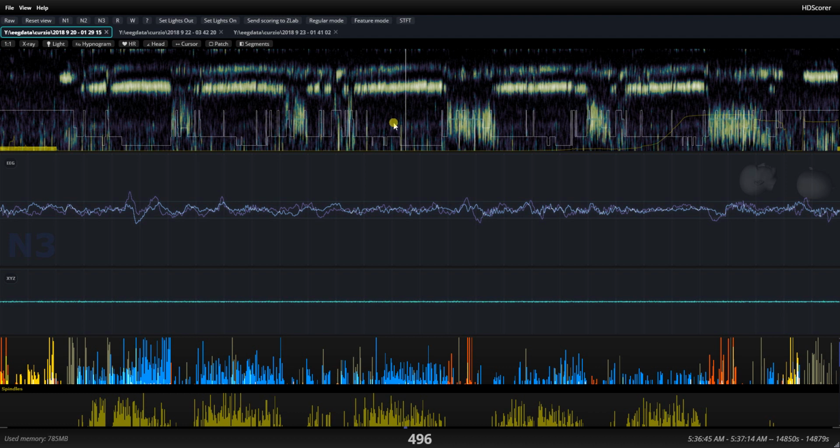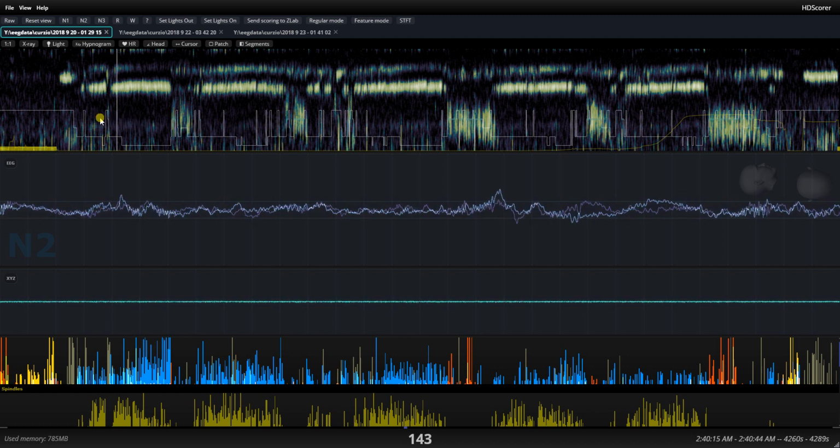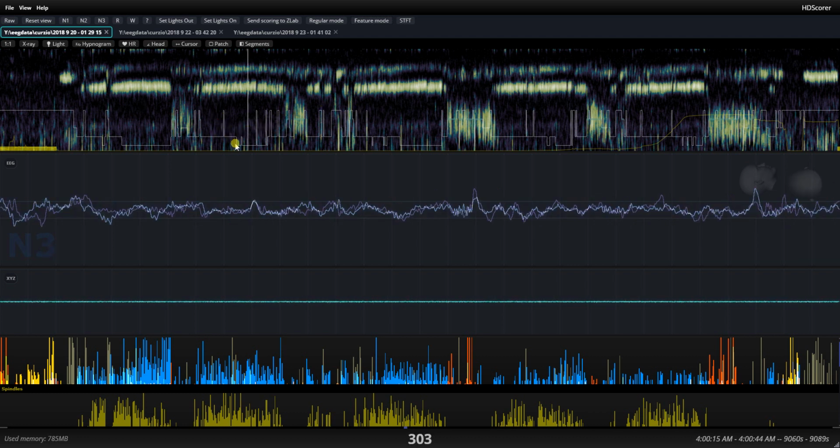On the other hand, by smoothing it, I think it gives you a lot more information, because what you can see is exactly what you would ideally want to see in the sleep here. Yeah, I did get to N3 in the first 4 cycles, but I spent a considerable portion of these cycles, namely the first half of each, in N2 sleep. I don't care to see the N2, N3 thing go back and forth very much. I'm much more interested in knowing that this general area was deep and the area previous to that was less deep. So these are small departures that I'm making from AASM.